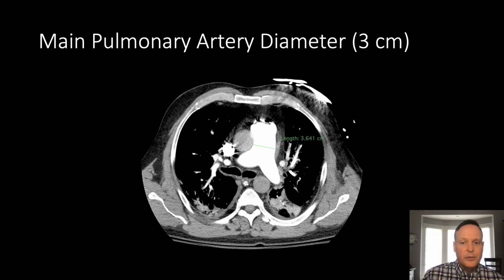That is my quick run through of basics of assessing for pulmonary embolism. Thank you.